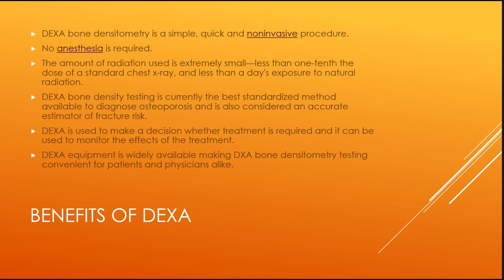Dexa bone density testing is currently the best standardized method available to diagnose osteoporosis. It is also used as an accurate estimator for future fracture risk. Dexa can be used to make a decision whether treatment is required. It also is used to monitor the effectiveness of the treatment that you are on.